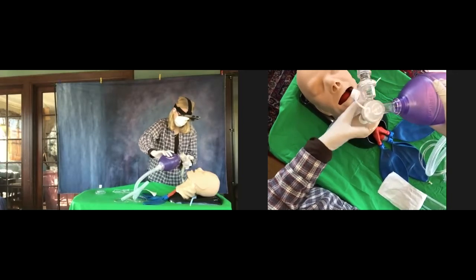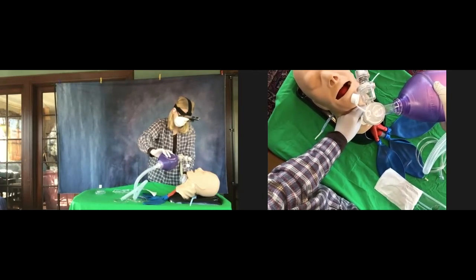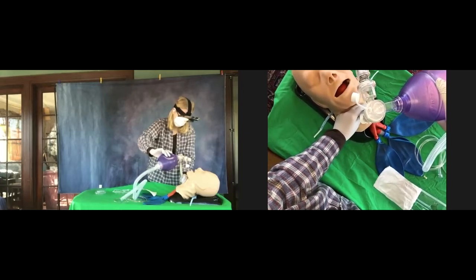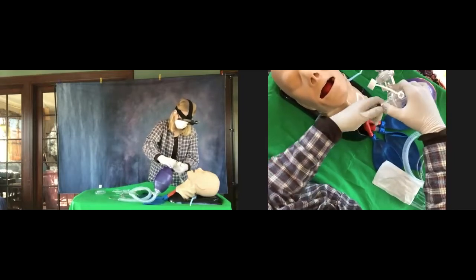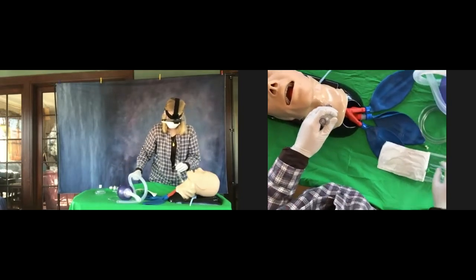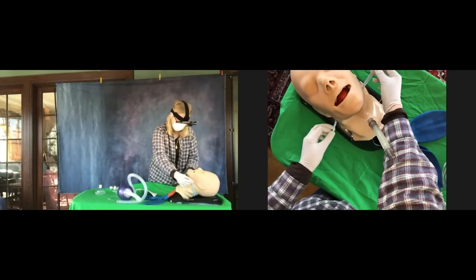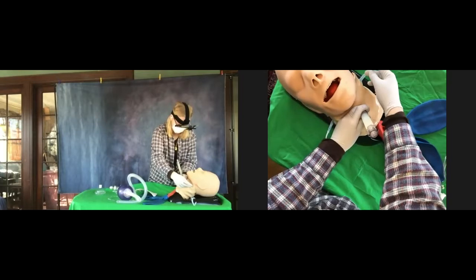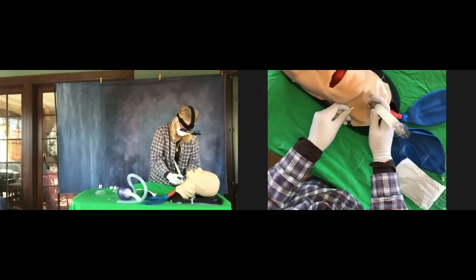Good. Put your left hand back down on the airway. Now squeeze gently. All right, now take off the bag valve mask — just pop it right off. Now pull the strap up from behind the head and put it through those little wings on the airway. Don't let go of the airway — keep one hand on the airway at all times. Pull up on one side, put it through that tiny little wing and velcro it to itself, then do the same on the other side.